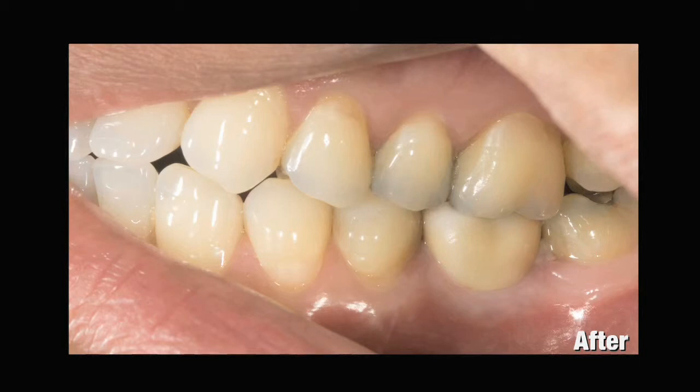These new technologies can help your cases proceed smoothly and predictably, ensuring patient satisfaction and long-term success.